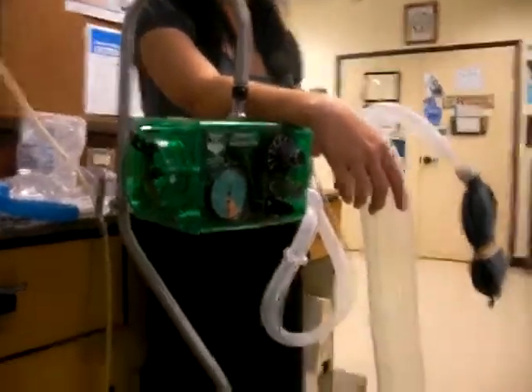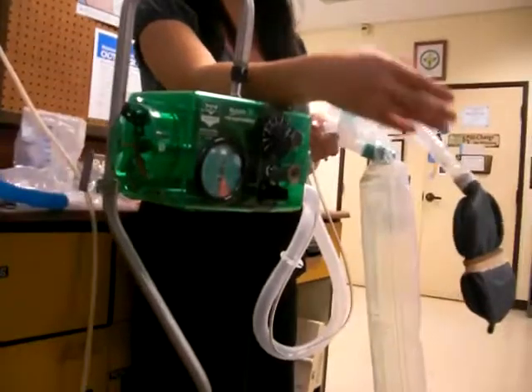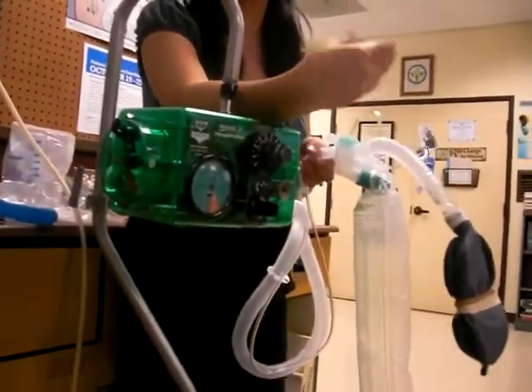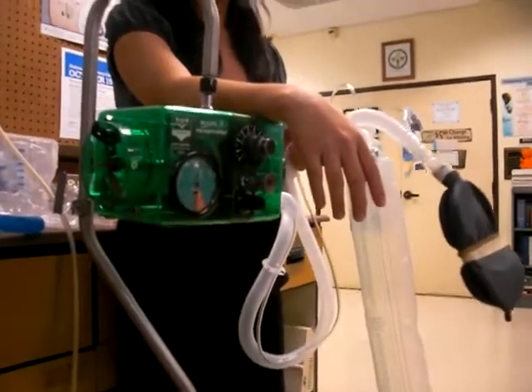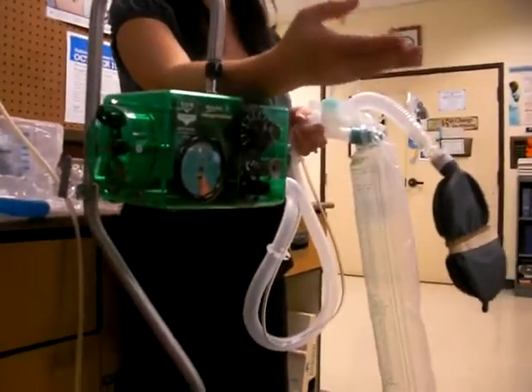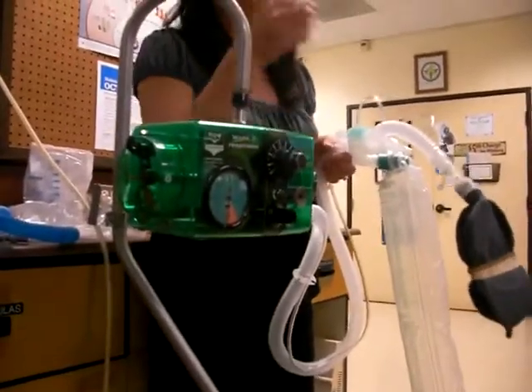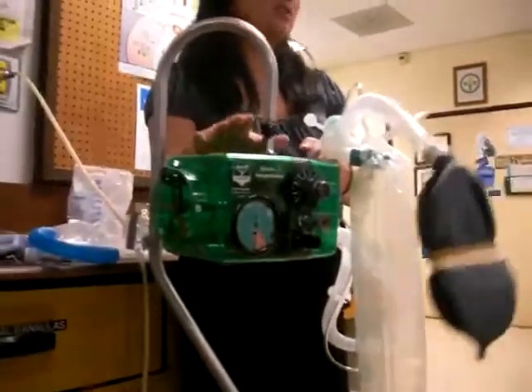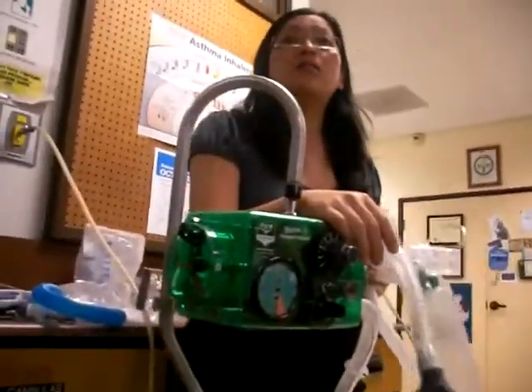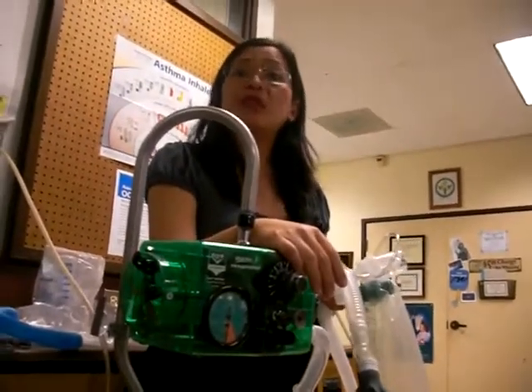All right, a lot of information on IPPB, but this was kind of the start of mechanical ventilation. Now you can imagine how it is next semester with the actual mechanical ventilation course. So when you talk about positive pressure ventilation next semester, this is a positive pressure ventilator. It's the first very simple one. If you can get how this works, it's easier for you to understand how to work with those high-tech machines back there. Okay, if you have any questions, let me know.